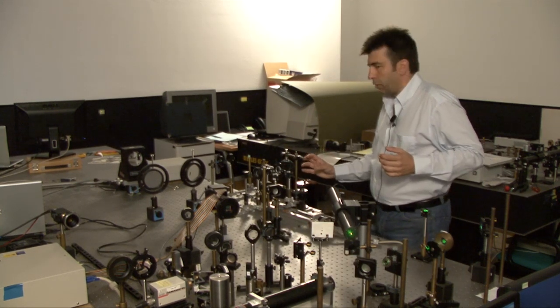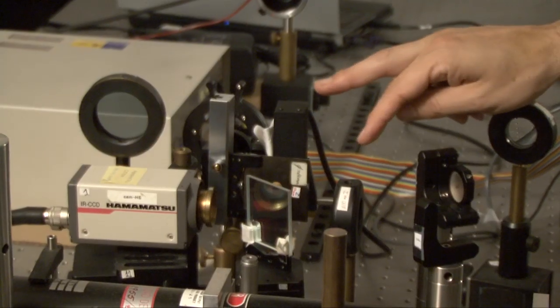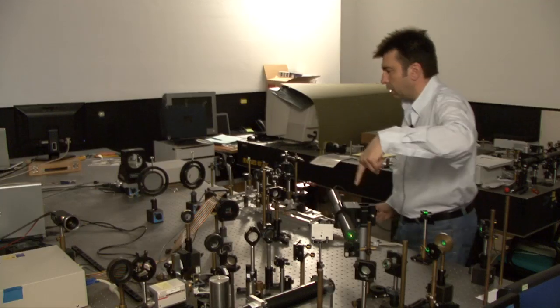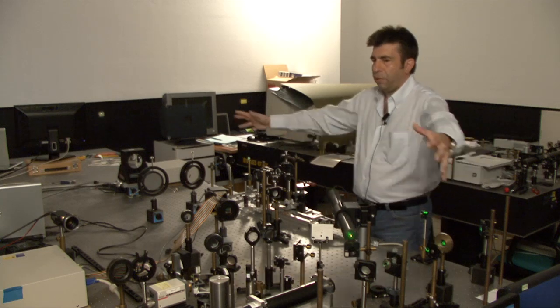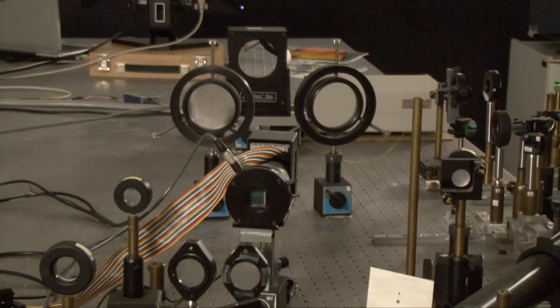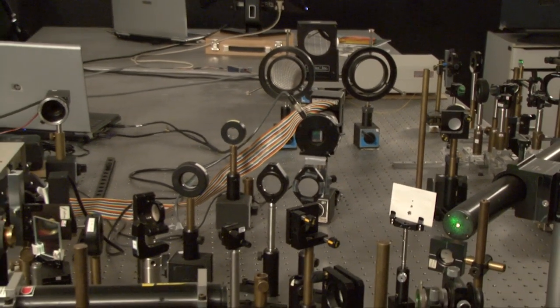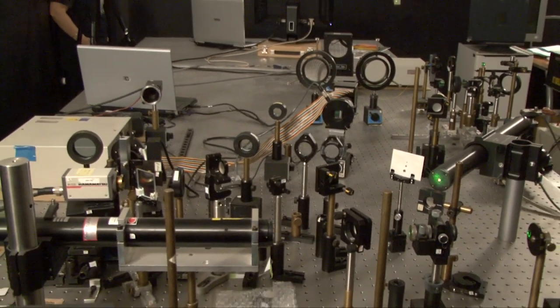When the subject is looking here, he is actually seeing any type of images projected through a small screen. This is a micro display, a tiny screen here, and it's inducing into the system. So you can imagine that this is like a complete artificial eye that we can really model, and is connected to an actual eye. And then we can just see the world through the eyes of anybody in a non-invasive way.